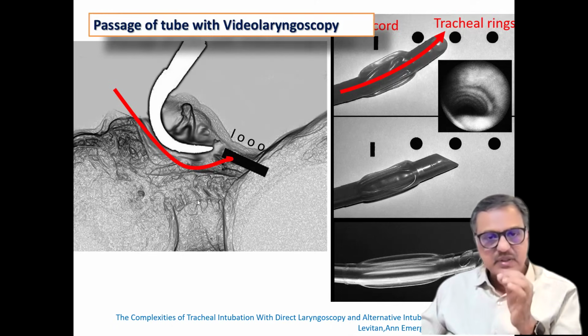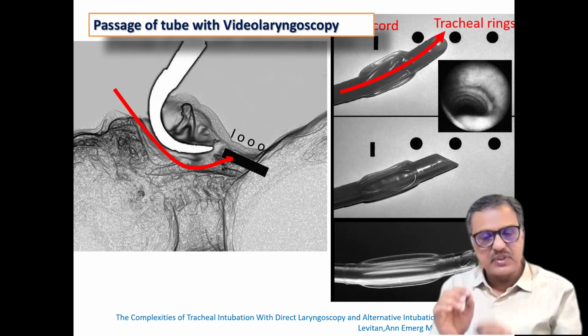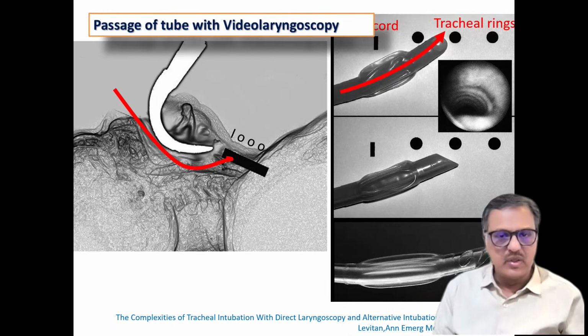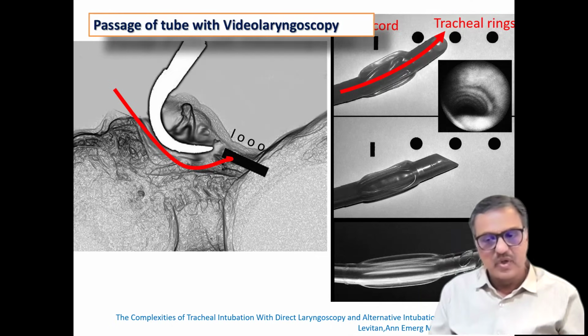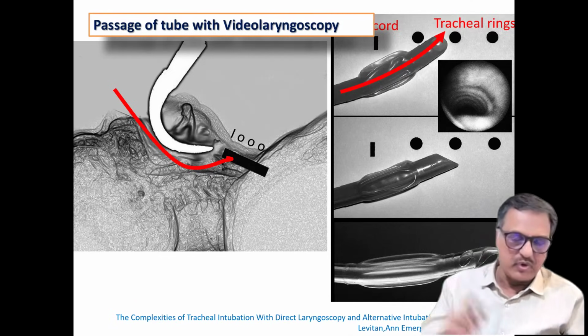So when you are passing the stylet-loaded tube, you have to keep the tip of the tube at the larynx and just advance the tube while at the same time withdrawing the stylet a little. That is one solution. Or reverse loading of the tube, which increases the chances of passing the tube inside the larynx with less trauma. Or using a flexible tube. I am going to post the video of all three in a couple of weeks.